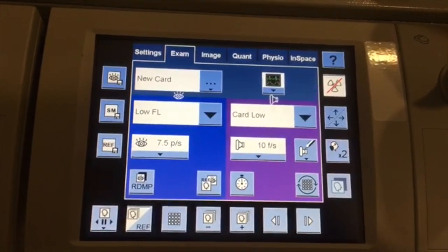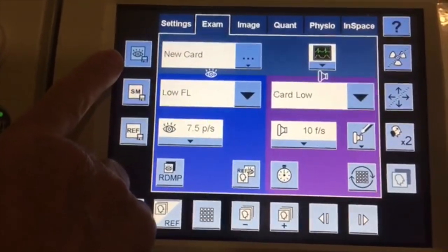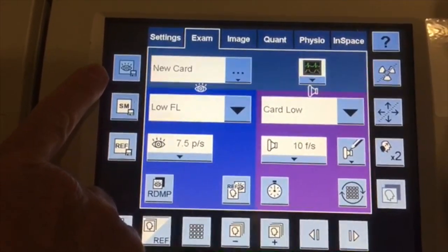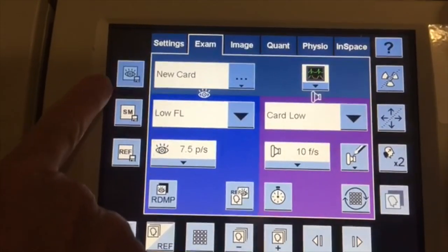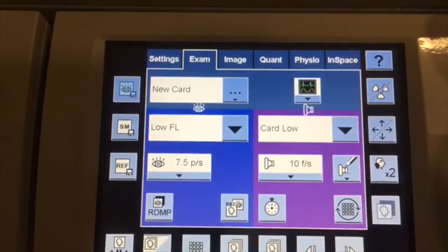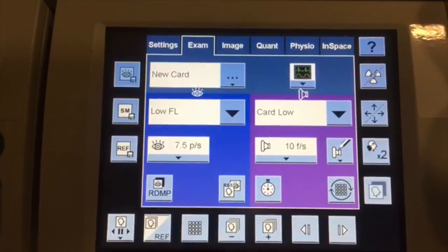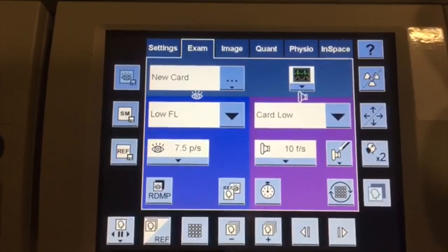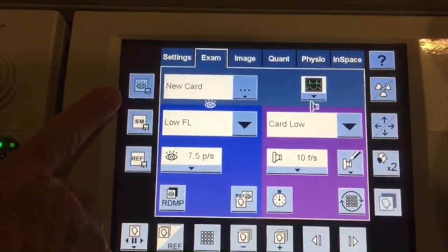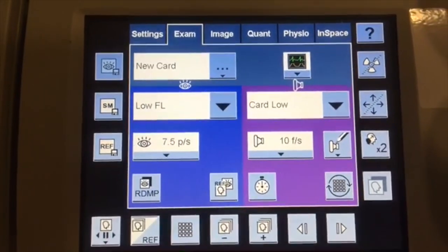Over here I want to talk about the store fluoro button. This is used if you want to store images without going into the acquisition program — you'd be storing under fluoroscopy. Otherwise we'd have to come over here under acquisition, and as I said earlier, using acquisition takes your MA from the 100s up into the 400s, 600s, 800s to take images. Be aware that you can store over 1,000 frames of images under fluoroscopy by using this store fluoro button.